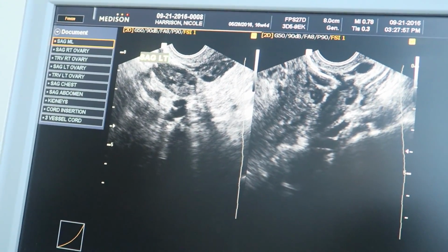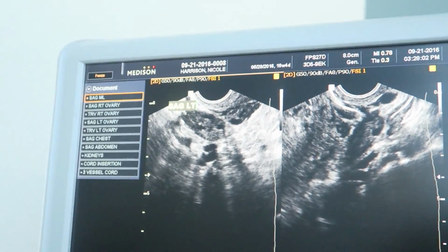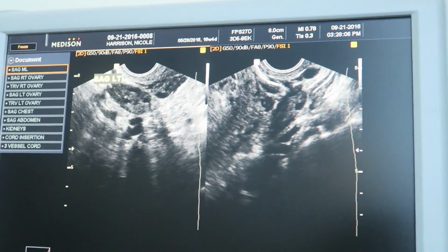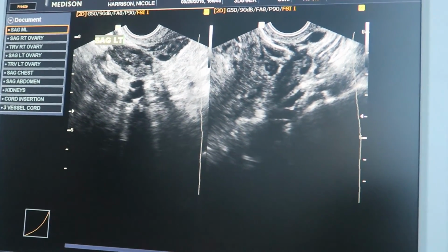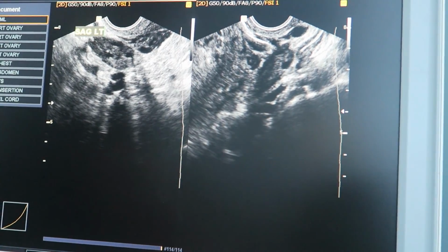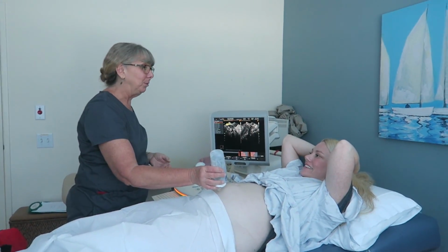For sure there's only one. For sure it's in the right place. I'm going to come and scan abdominally again. Your anatomy is normal, and there's no markers at this stage. Markers meaning any features that raise a red flag. Oh, good. So now you're going to push yourself up, and I'm going to see if I can. Yeah, you can't tell. There's normal fluid at this point.